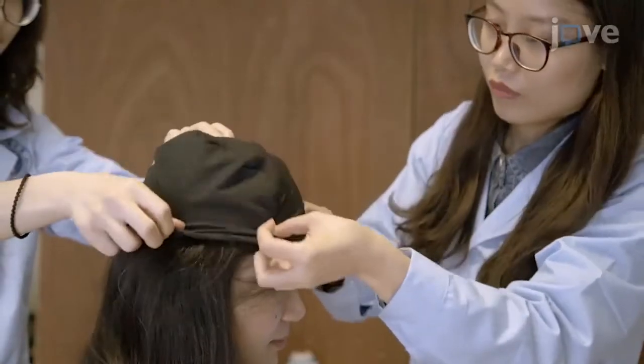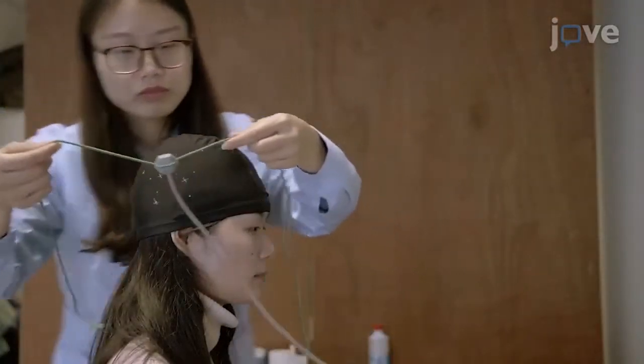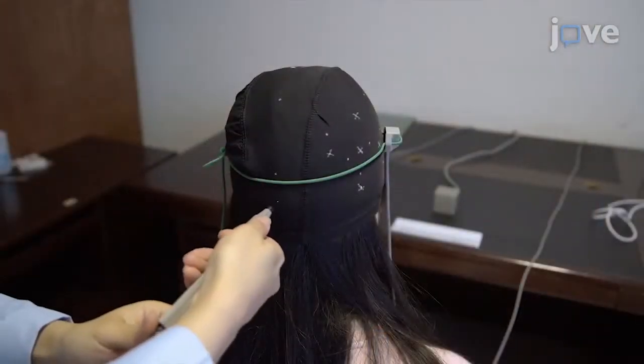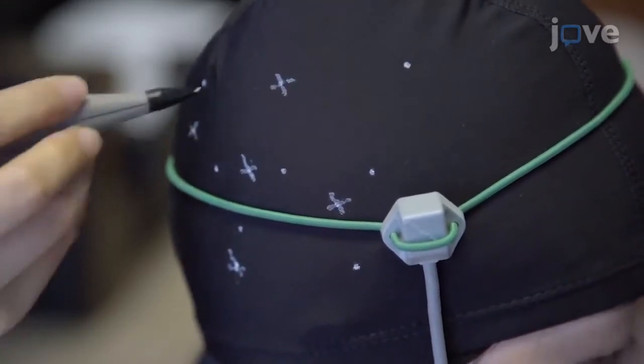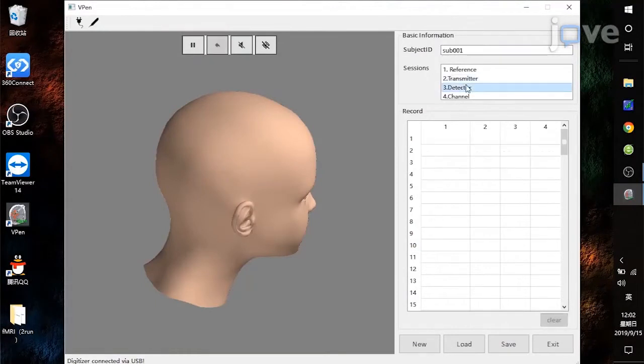This method is suitable for use with other techniques, for example, functional near-infrared spectroscopy, to verify the location of specific brain regions of interest. This technique is very simple if you are familiar with the proportional requirements of the 10-10 system.